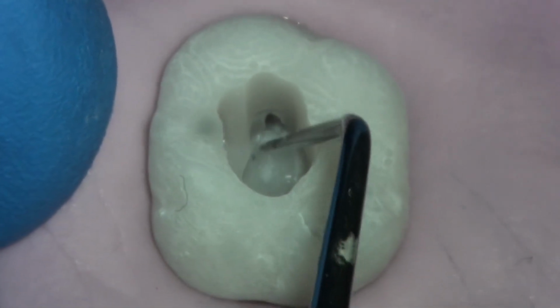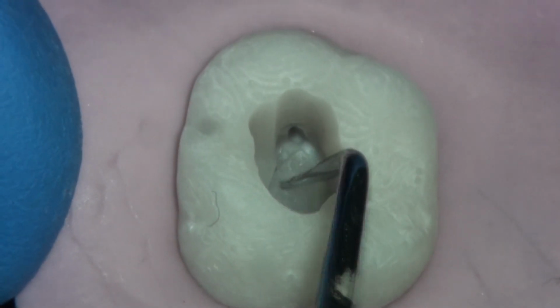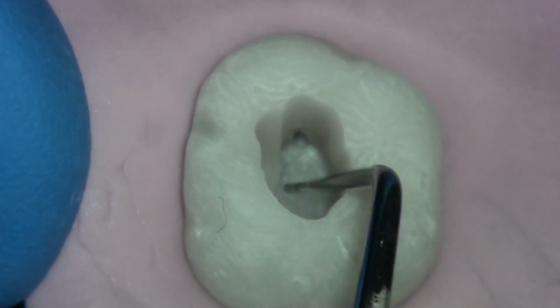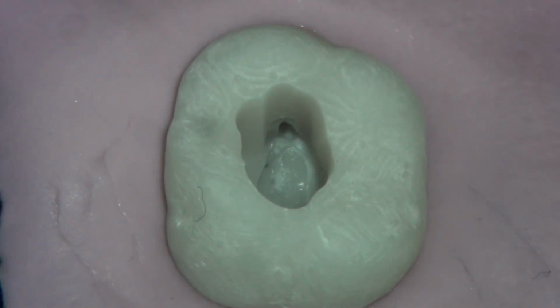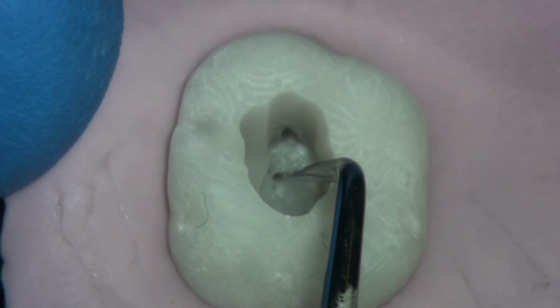And then we look for a line, of course, running from the MB1 towards the palatal, which is here. And the literature would tell us that the MB2 is located along this line, and it should be around 2 millimeters back based on the literature. But for me, it's just a question of scouting along this line as opposed to looking for a particular point, because the canal can have a very different configuration depending on the anatomy involved.